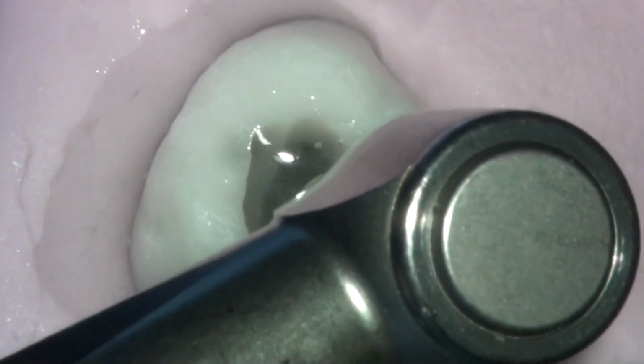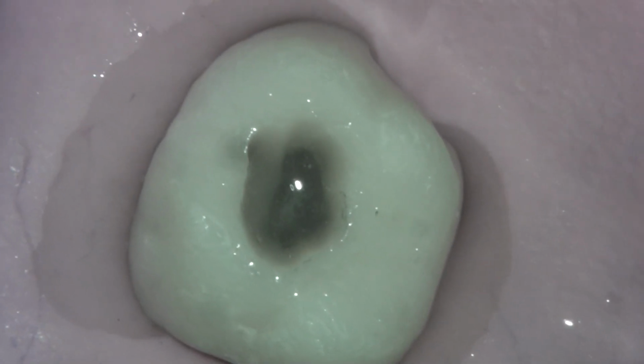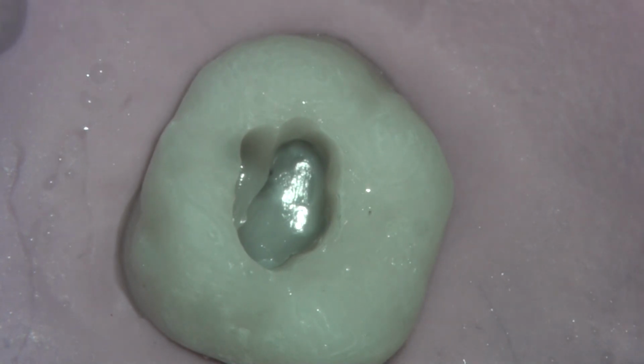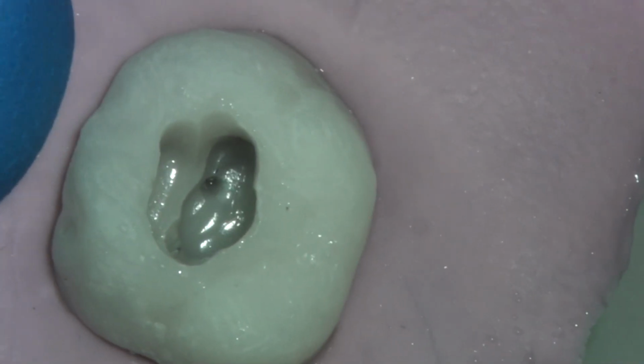We're always brushing on the outstroke, and we are going in 3 or 4 passes before we stop, and we re-irrigate to get rid of all this debris. A little spray of air again, just for us to visualize this a little bit better. And we will see that we are now establishing a more defined coronal shape associated with the second mesiobuccal canal.